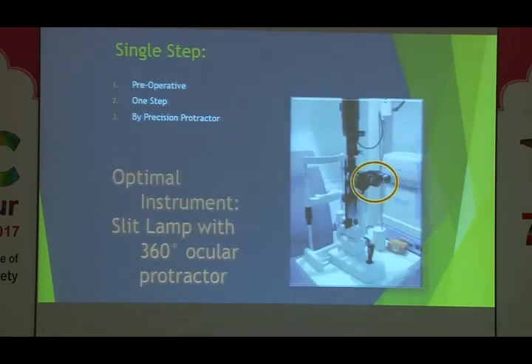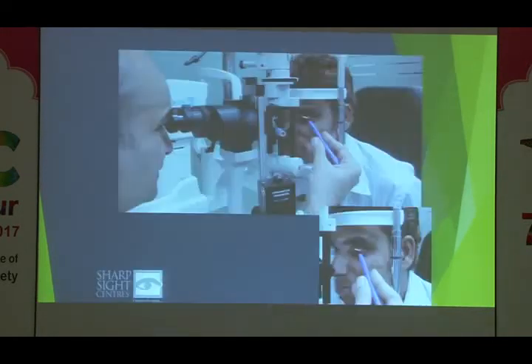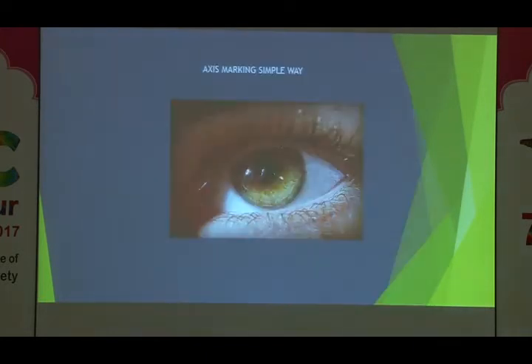Secondary marking. What I do is I use a slit lamp. You could use a graticule or you could use a slit lamp. Just make the beam 13 millimeters, thinnest slit. Make sure the patient's head is straight. Align the optics. Earlier I used to do it in an undilated pupil, then dilate. Now what I've started doing is, there's a video, I hope this video should play, this is interesting. So even in a dilated patient, you see, necessity is the mother of invention.